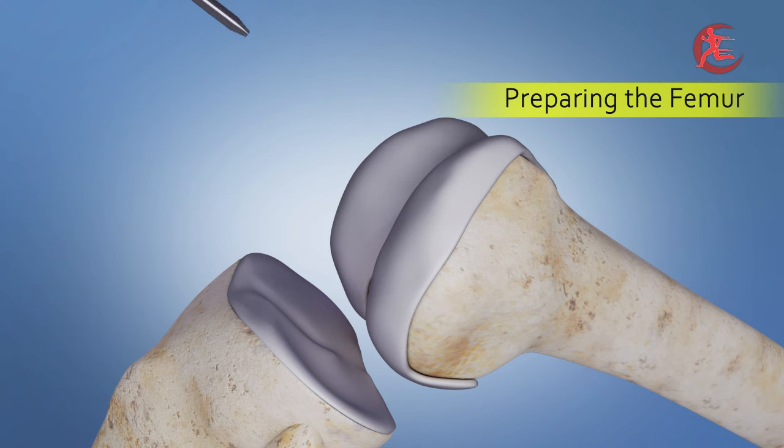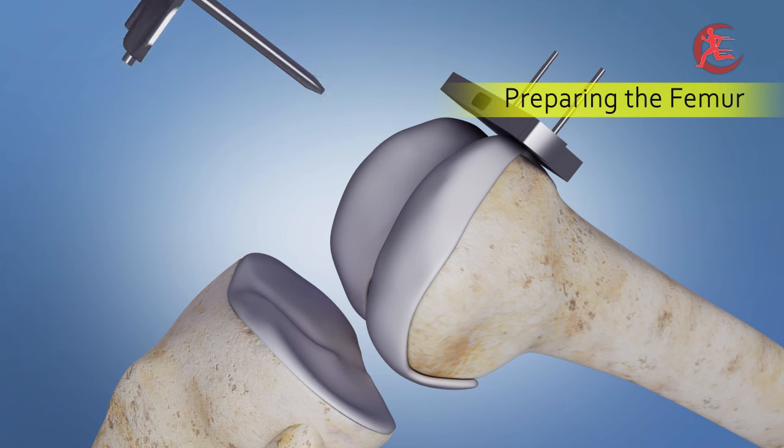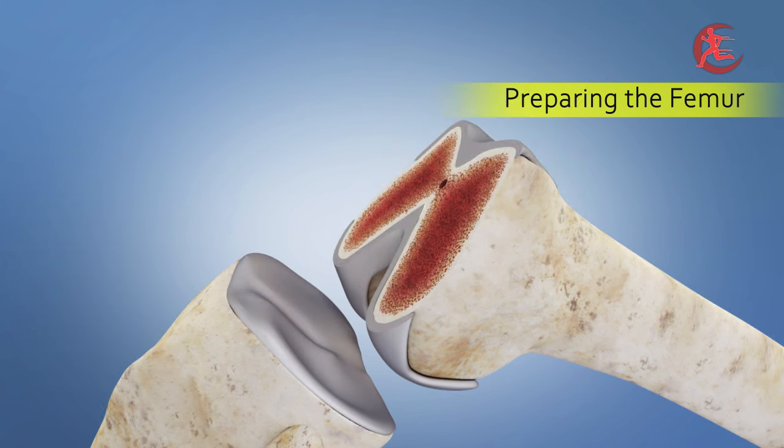During the surgery, your skilled surgeon will use a set of specialized guides to carefully remove the damaged bone, and prepare the femur, ensuring a perfect fit for the new implant.